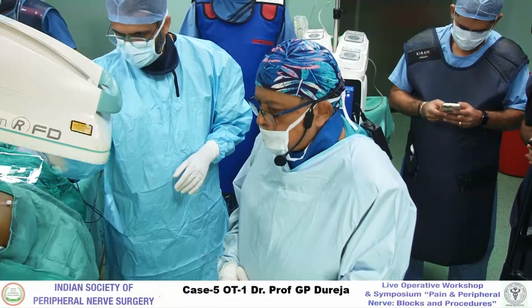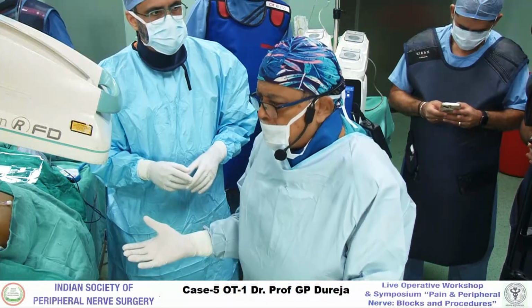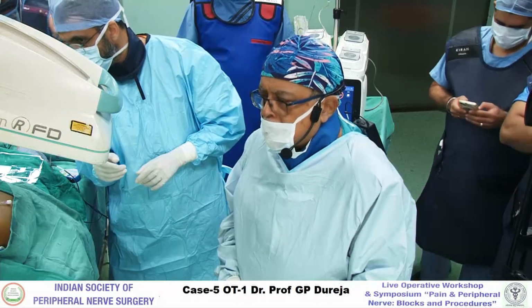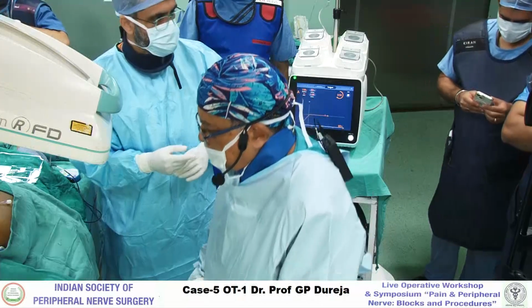Can you show the entry point on X-ray? Same. You have to block the medial branch. Okay. Same. Okay. Thank you, sir. Thank you. Thank you. We will shift to next OT. Yes. OT.